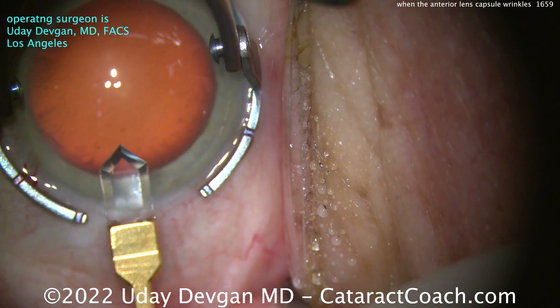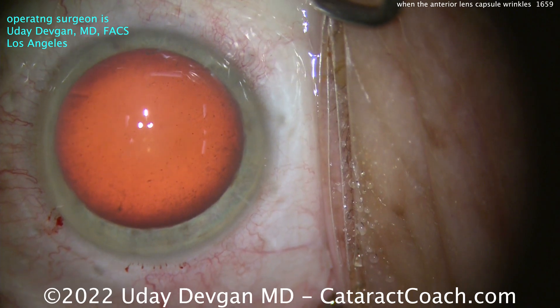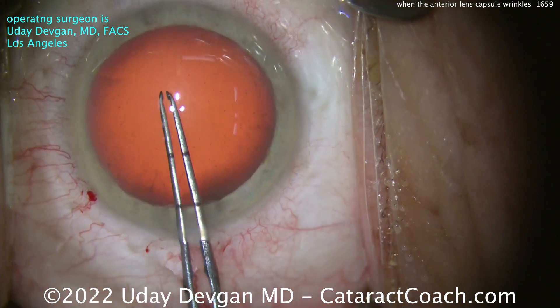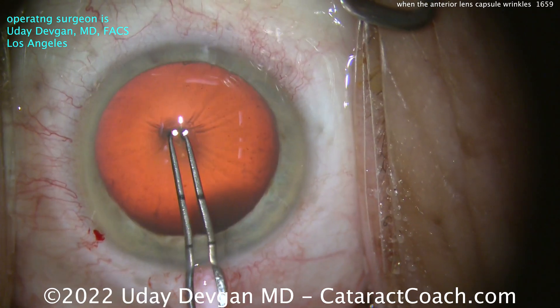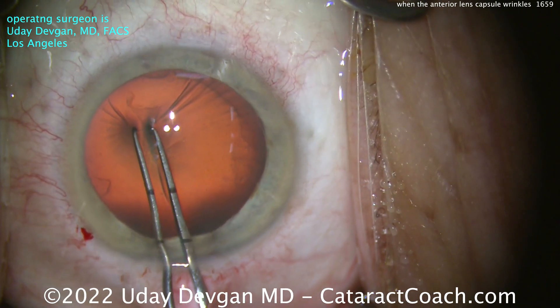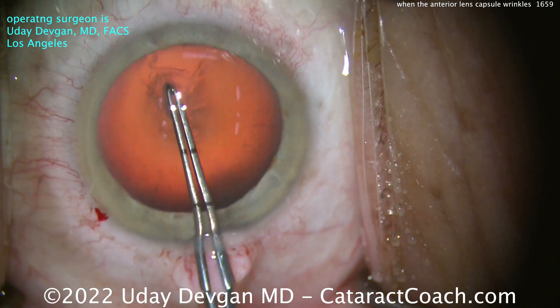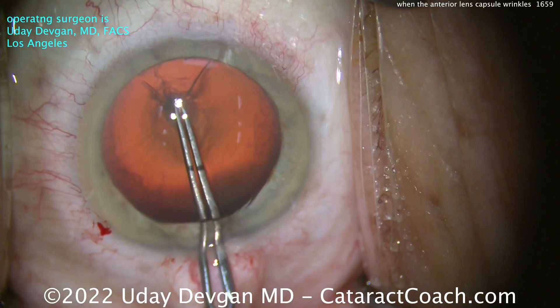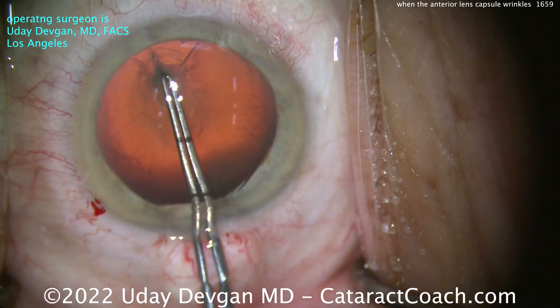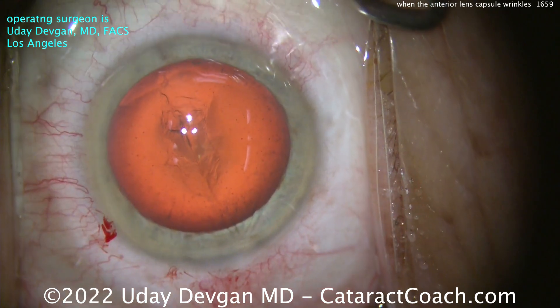Now let's look at the lens capsule. We'll go in with our forceps — here's the part you're waiting for. These are pretty sharp. We poke down in the middle, and I can't poke through. I try again, try just to scrape along the surface, and it's really difficult to puncture the lens capsule. There's a lot of wrinkling going on here, so now I'm getting a little nervous. This forceps is just not sharp enough to penetrate, so I'm going to stop here.